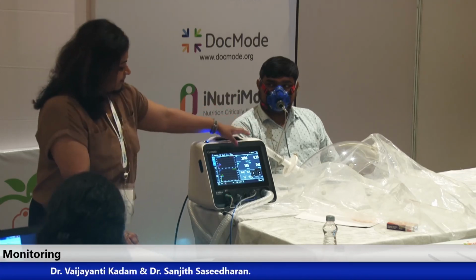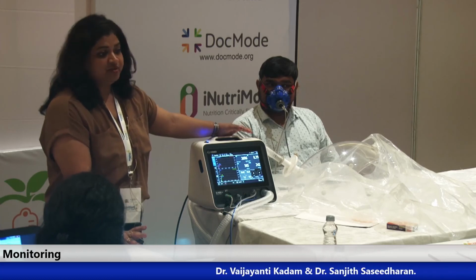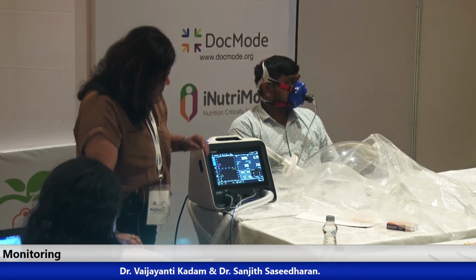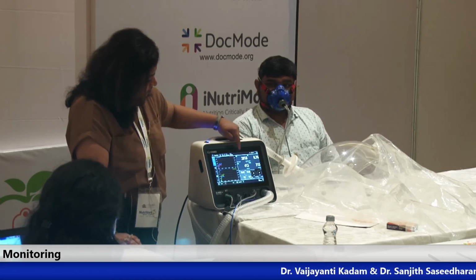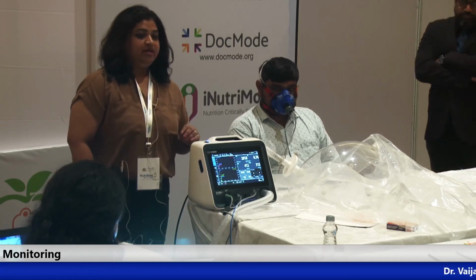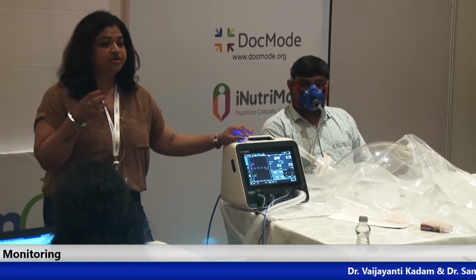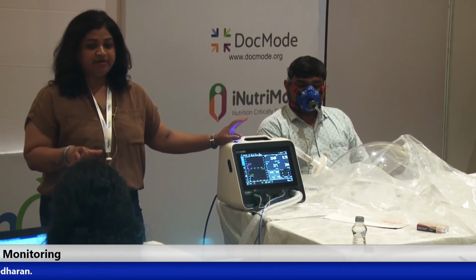Sometimes some patients' requirements are very high, and as per the weight base we are giving them very low. So underfeeding and overfeeding is something which we can avoid in these patients. So see now what is happening over here. See, his requirements are going up. So now this graph, because the steady state is moving. In a patient who is breathing very fast, or a patient who has fever, is tachypneic, hyperventilating, the steady state will not be achieved very quickly. In those patients where we want to understand the resting energy expenditure, it is not the right time to see. So let the patient settle for some time.